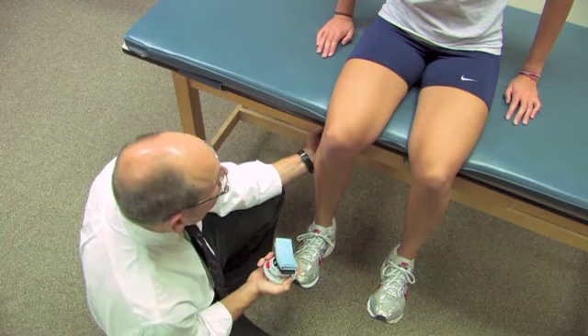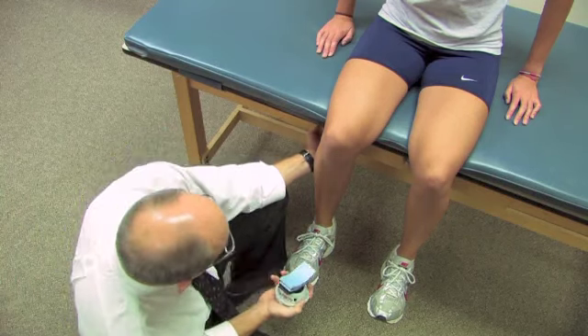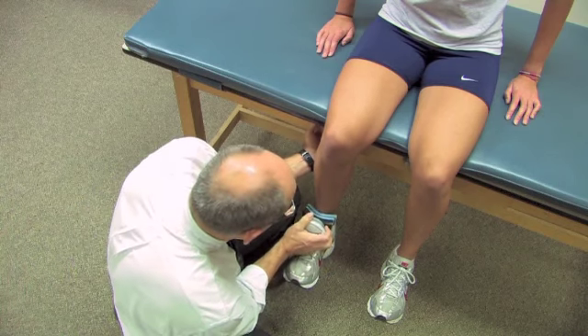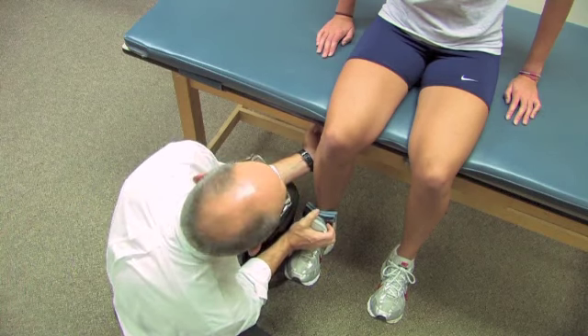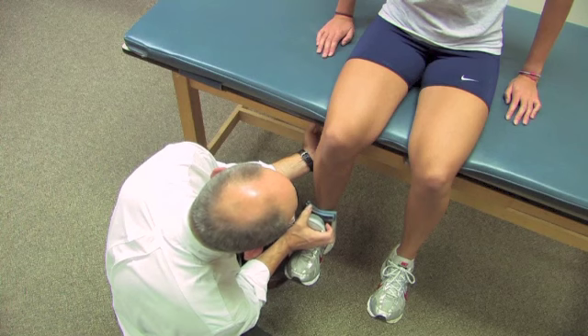I'm going to hold onto the table because if the person is strong, I need to be stabilized so I don't get pushed away. I'm going to come in here, place the device, and the instructions are going to be the same. When I say go, I want you to take a second or two to come to your maximum knee extension effort and continue with that until I say stop.